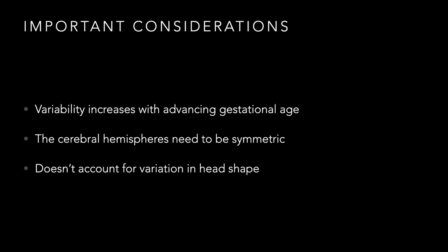And it probably becomes even more obvious when you say, look, there are some babies that are born at 6 pounds, some babies that are born at 10 pounds, right? And so you're going to expect to see a size variability later on in pregnancy, right? So expect that to become more variable as the baby gets older.